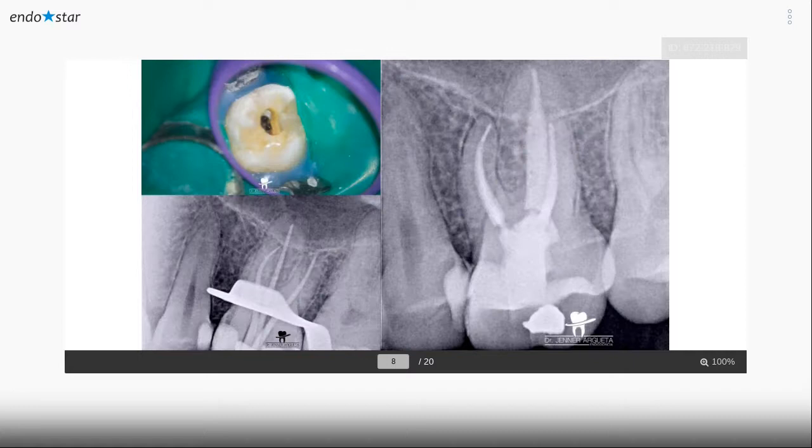But almost when I was finishing the shaping of the root canal system, I was working in the MB2 canal. I was able to go smoothly with a 25/06 file inside, and then I decided to go inside with a 35/04. Something in my mind told me, like that little angel that tells you do not do it, I have that voice in my mind that told me, Jenner, don't go inside with that 35/04. And I just decided to go inside and I broke the file.